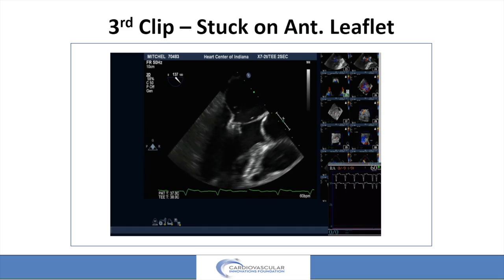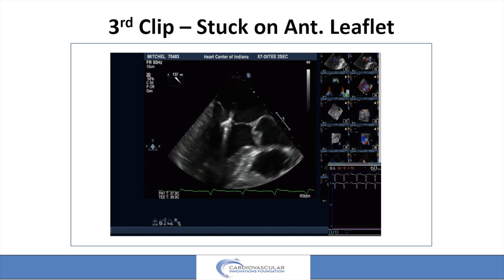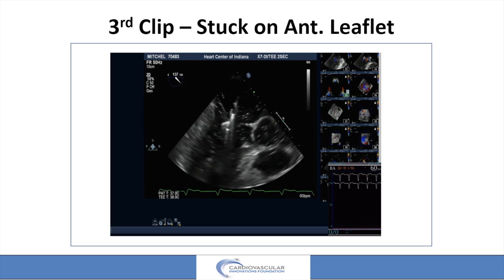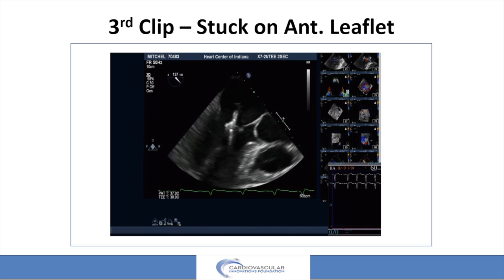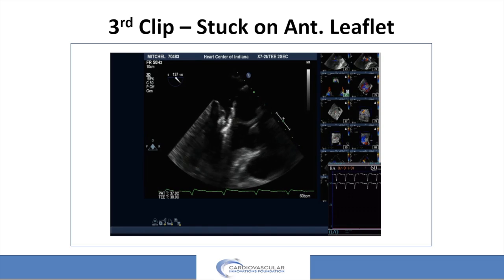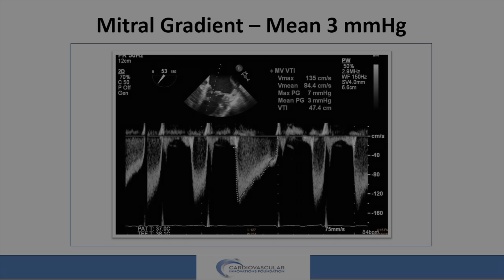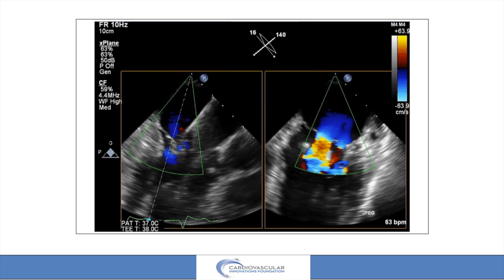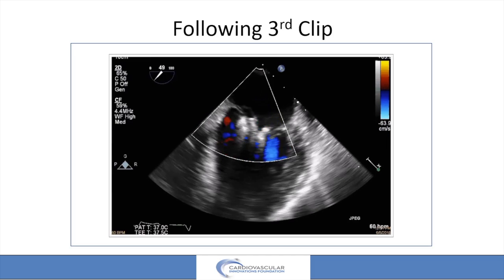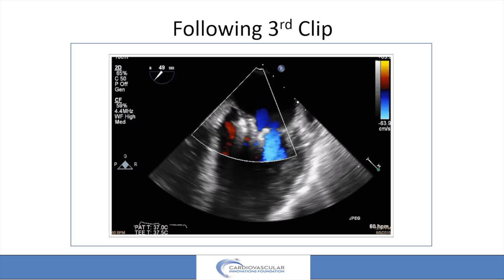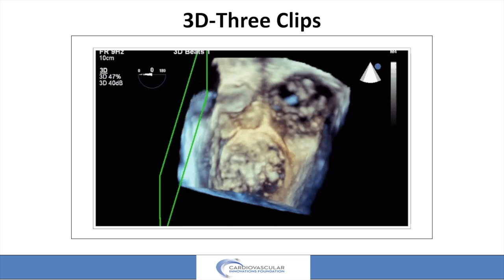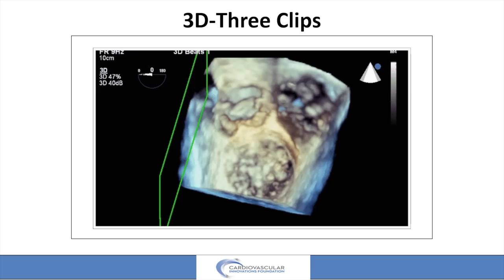Here comes the third clip in. With this one, the gripper gets hooked on the anterior leaflet, so we have to fuss around with that for a while — cycle the grippers — and finally after cycling them enough, we get it off. Then we come in and really nicely engage. Once we close up that third clip, we've only got a three millimeter gradient. We release, and all we've got is this little jet right out here laterally, but really nothing else. From above, we've only got a three millimeter gradient.